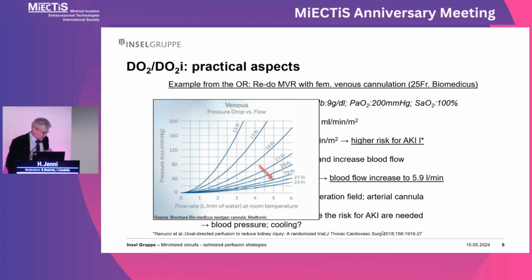And on the other hand, in the hospital we teach, I always tell my students, okay, now we have a situation, your DO2 is perhaps lower, but that will not mean that your patient will now have a kidney injury. This patient has a higher risk now. You can imagine on your screen, you have a blinking parameter. Oh, this parameter is now in red or something like that.